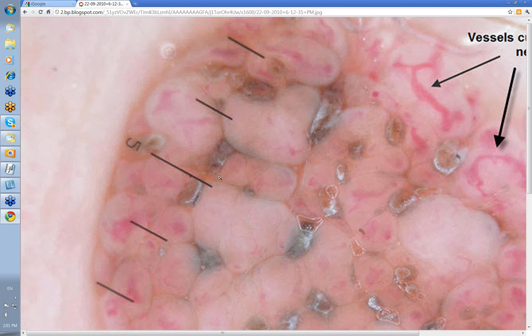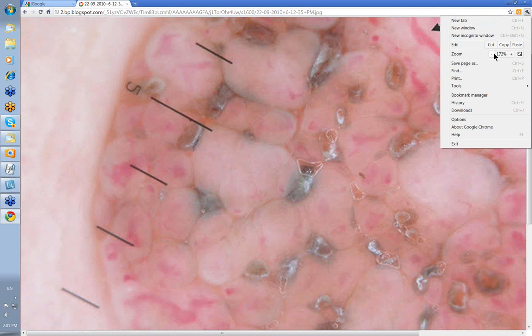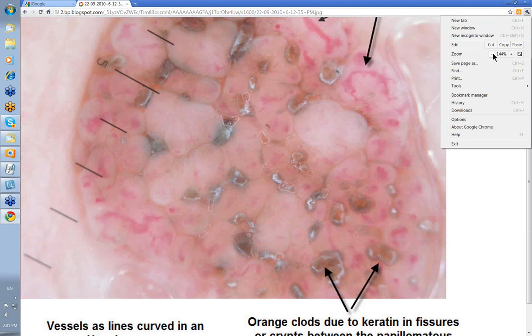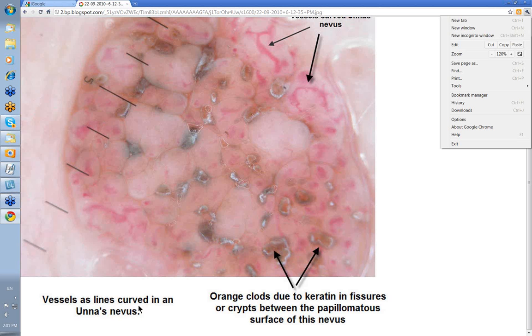We talked about an Unna nevus. This is the picture of an Unna nevus. Here you have these curved vessels that you see in this papillomatous Unna nevus, and these orange clods with keratin and fissures between the papillomatous surface. So vessels as lines curved in an Unna nevus.